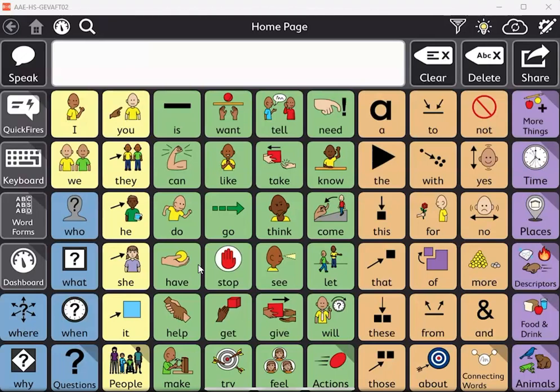Motor planning, repetition is really important for students. One of the strengths of TD Snap Motor Planning is that it's intuitive. It makes sense. It's user-friendly. The organization helps everyone feel more comfortable with it.